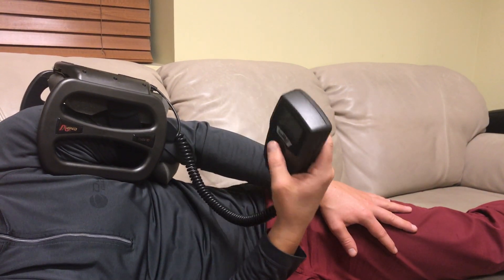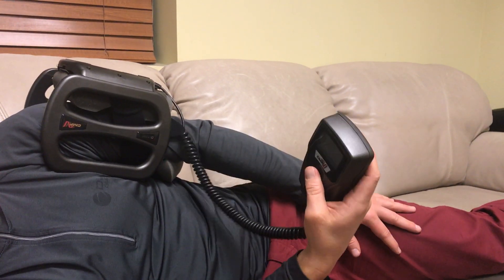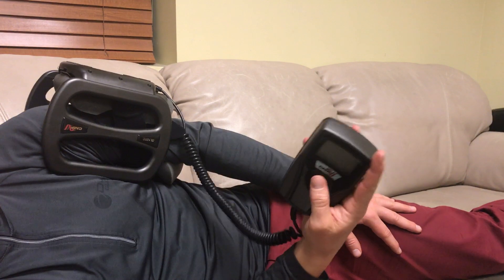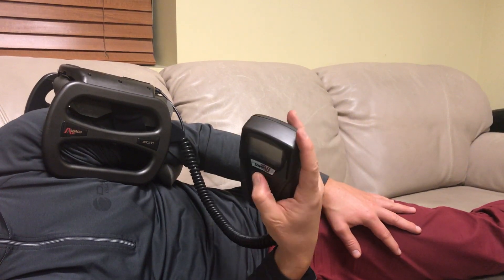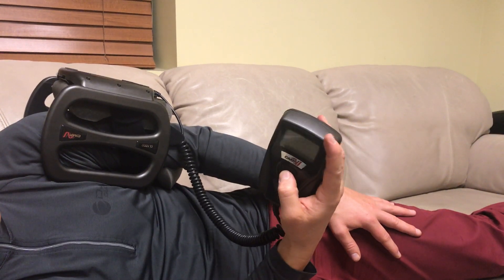You're going to do it for 30 minutes, once a day. Try to do it around the same time every single day so you get into a routine and don't miss therapy sessions, so that you can get the best healing outcomes. And that is your bone growth stimulator.